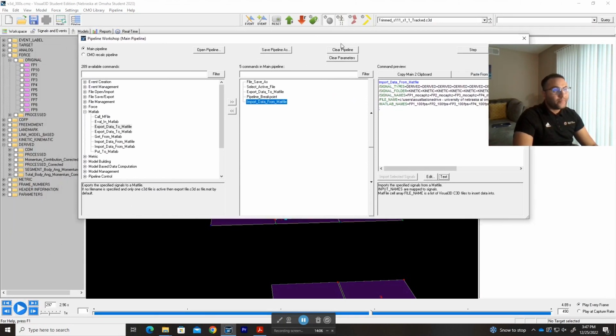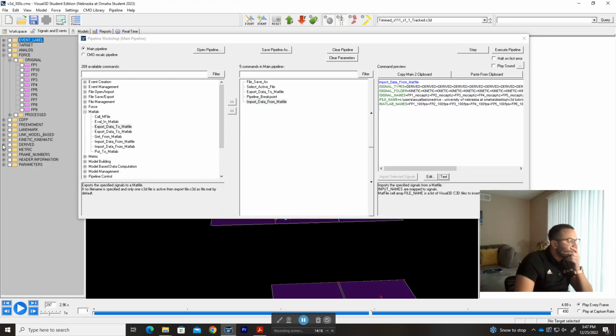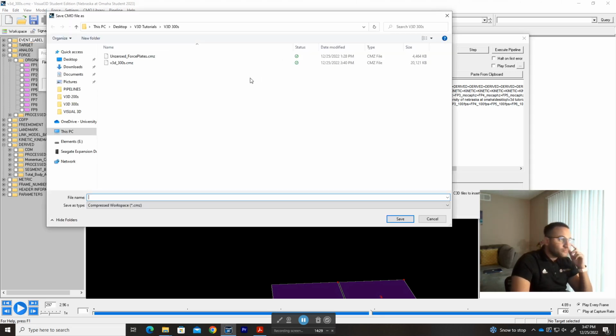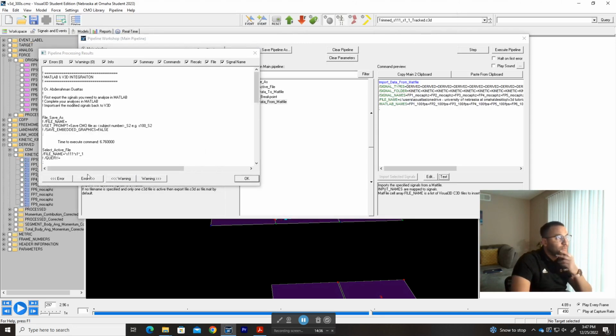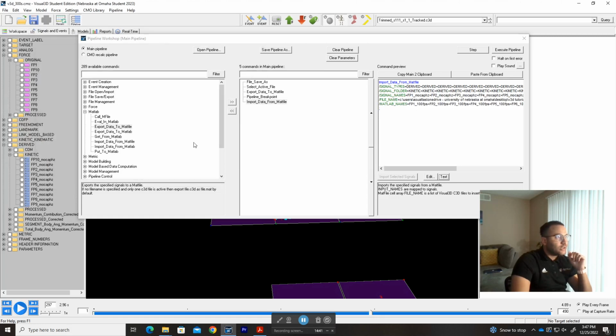When we go to the file that you chose here, so derived, kinetic, and all that, interesting, why did it not? Maybe I did halt it. Okay, probably I did not resume. So let me execute it again, and then let's resume. So now we actually resumed. I probably halted it earlier. And then we hit OK.